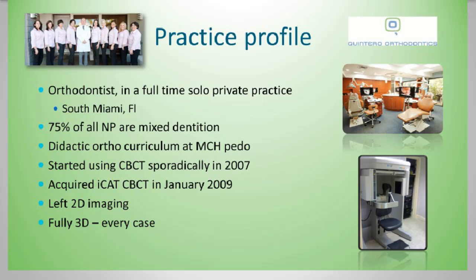We want to know what kind of condyles we're dealing with prior to the start of any type of invasive treatment, whether it be orthodontics or restorative dentistry. So in a nutshell, it really improves the diagnostic power of our treatment. But the one area that has affected my practice and changed the way I practice is the airways.